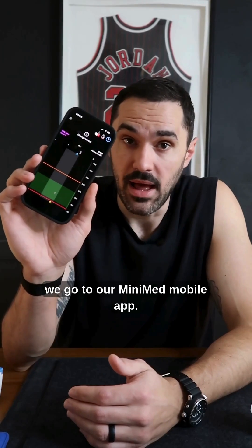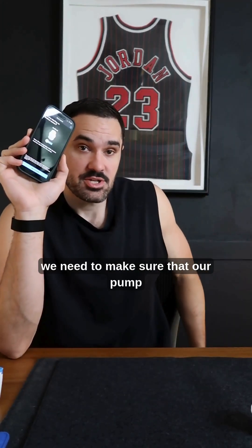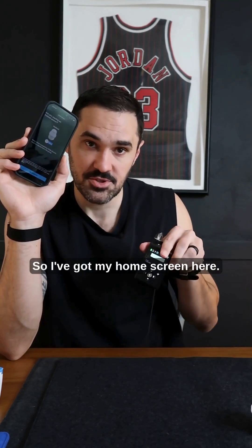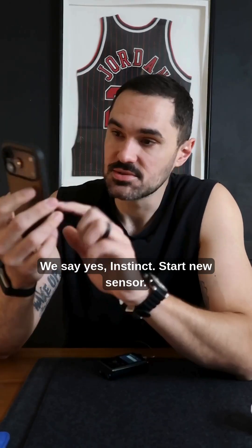Now we go to our MiniMed mobile app. In the top left corner on iPhone, we're going to tap the menu and click start new sensor. We need to make sure that our pump is on the home screen. So I've got my home screen here. We go back to our MiniMed mobile app, say yes, instinct, start new sensor.